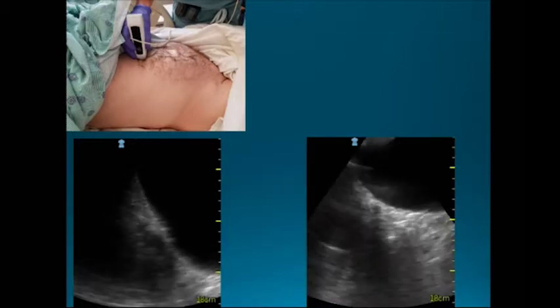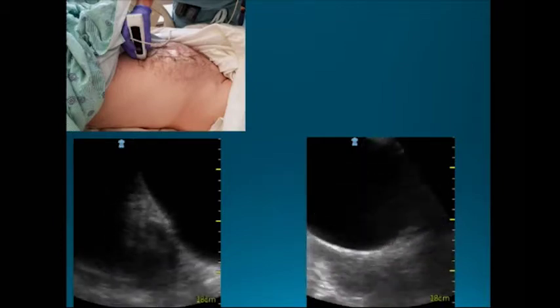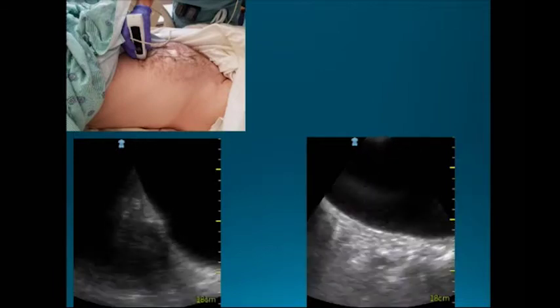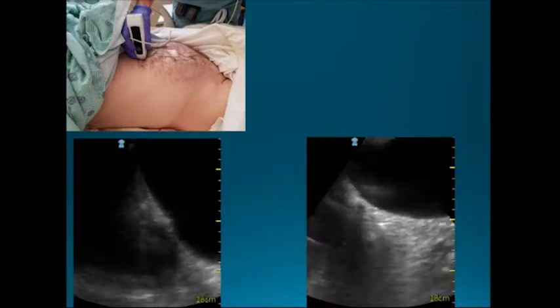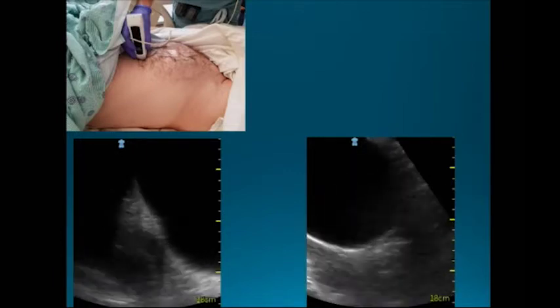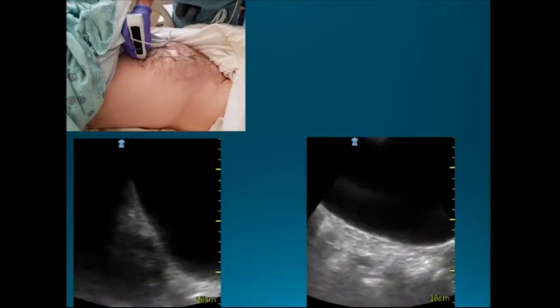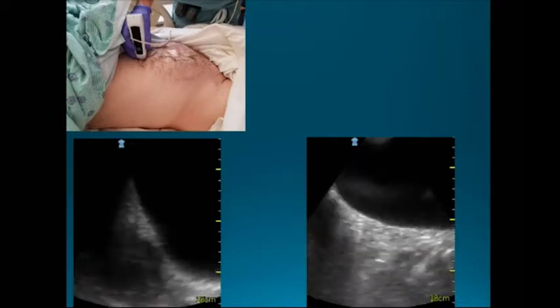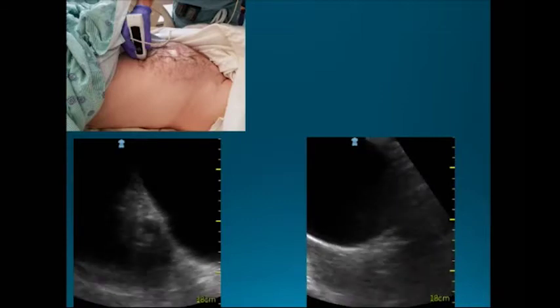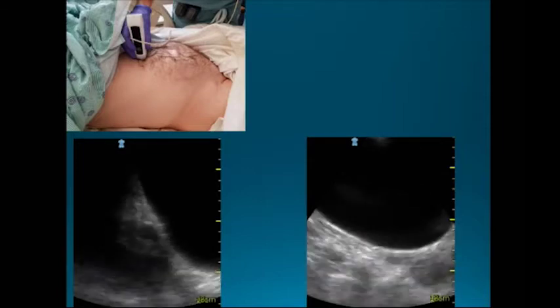And the more and more I look for this, because I've included it as part of a routine exam, the more and more I find this. It's just striking to me how many people come in with vague abdominal syndromes, or even just tachycardia, demented patients, altered mental status, a lot of times just vague, non-specific stuff, and it's something as simple as a bladder obstruction. This is readily diagnosed.